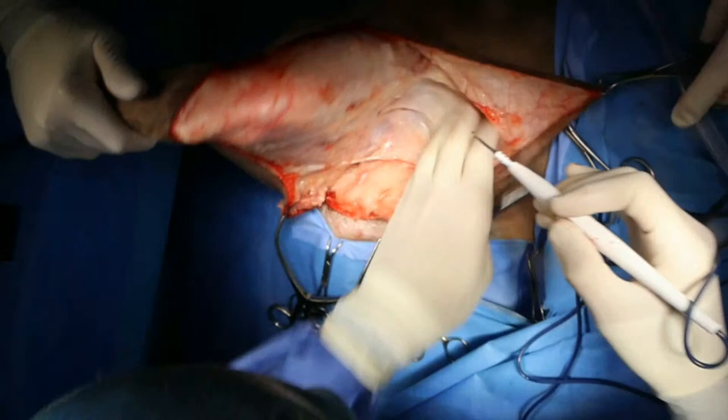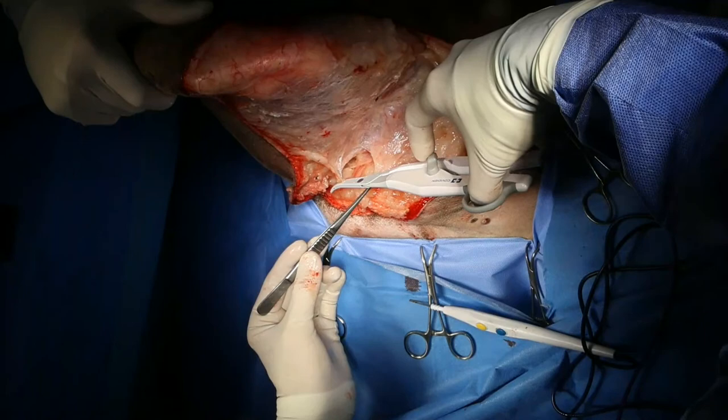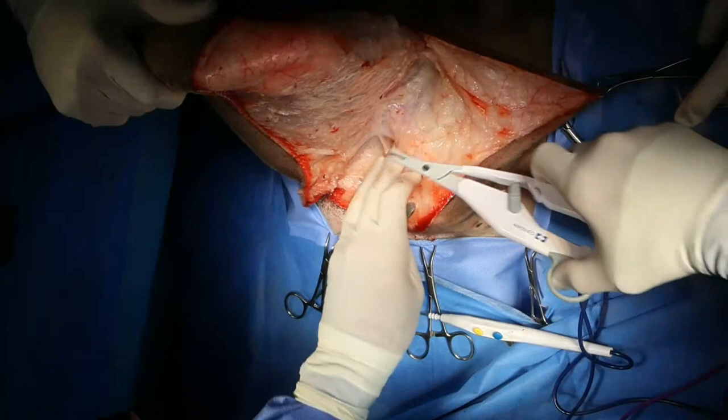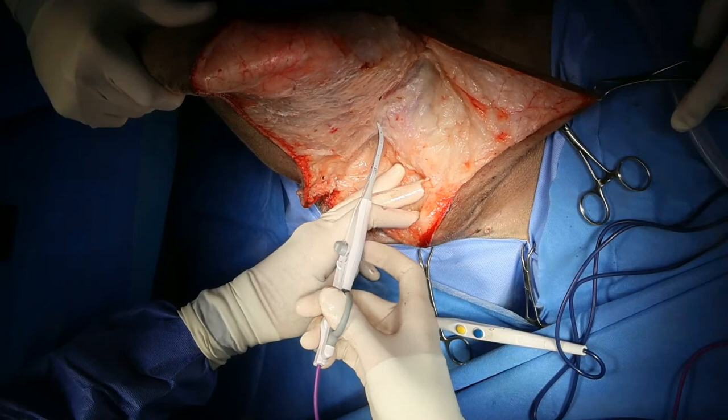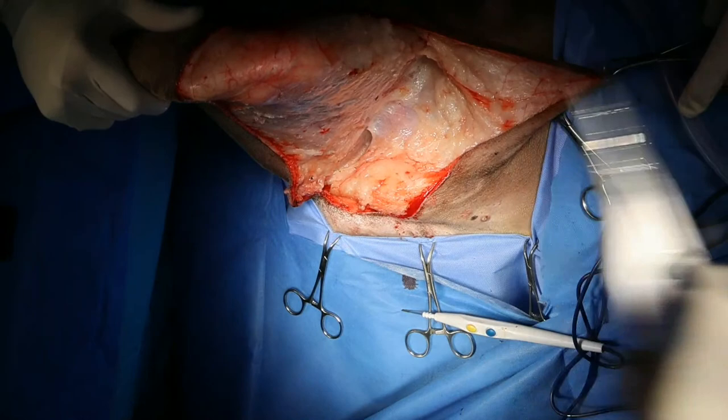Now, another quiz question. Do we need to cut any of the heads of the quadriceps muscle for this procedure? We have Sean shaking his head here. Final answer? Anybody else have any ideas on whether we have to cut any of the heads of the quadriceps muscle to do this surgery? Yeah, so Sean's right. We don't have to cut any of the heads of the quadriceps muscle.